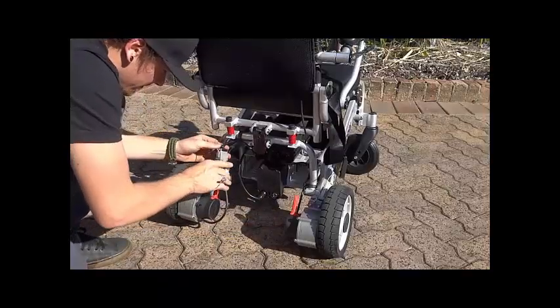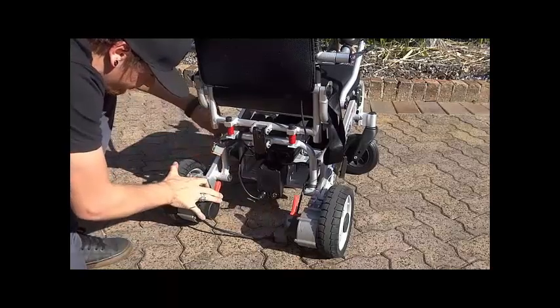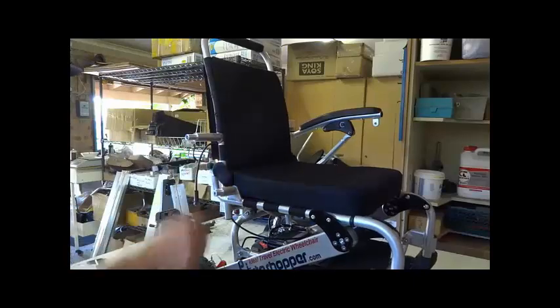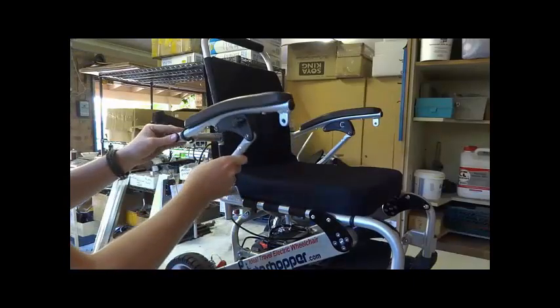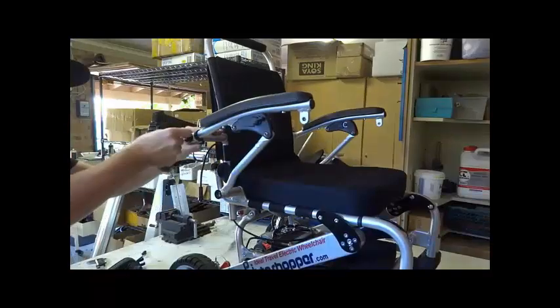This special includes free shipping to metro areas in the US, the UK, Canada, Australia, and most other western countries, as well as the built-in folding anti-tip wheels plus 2 batteries for more than 25km or 15 miles of range per charge.